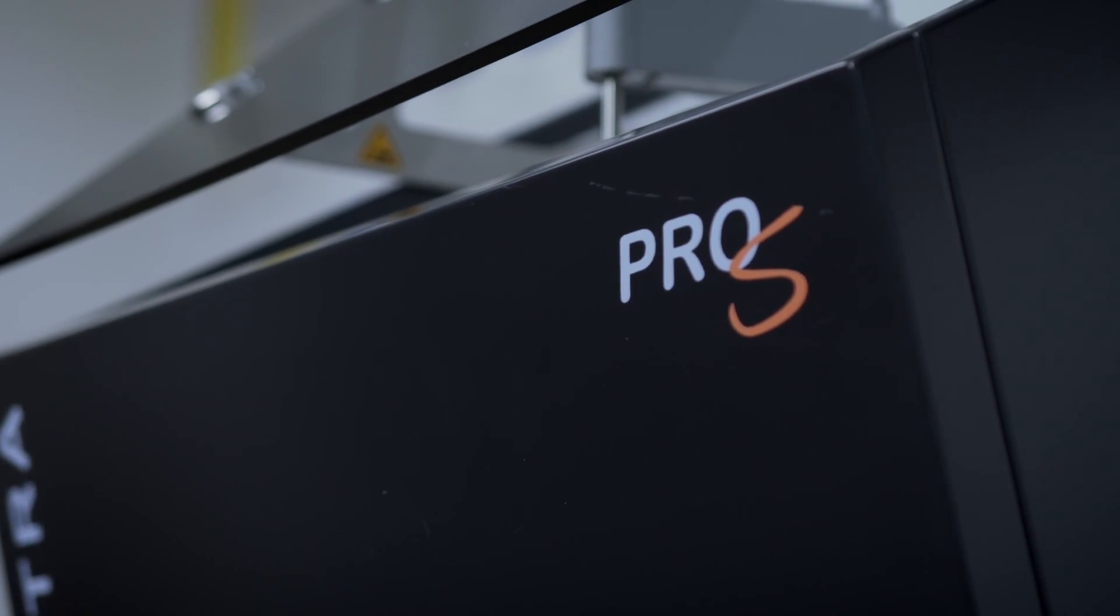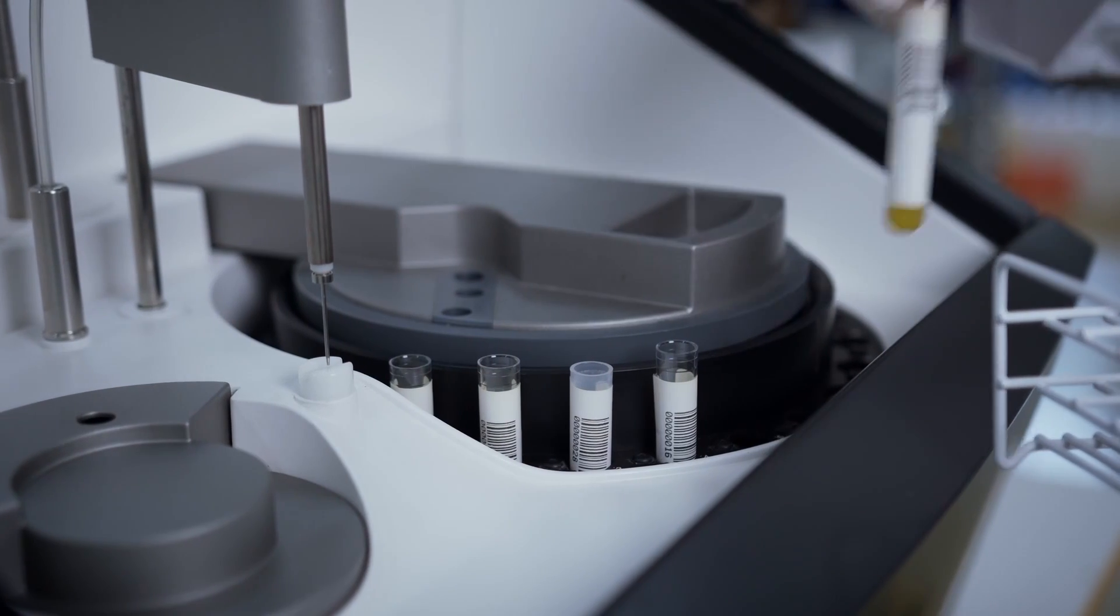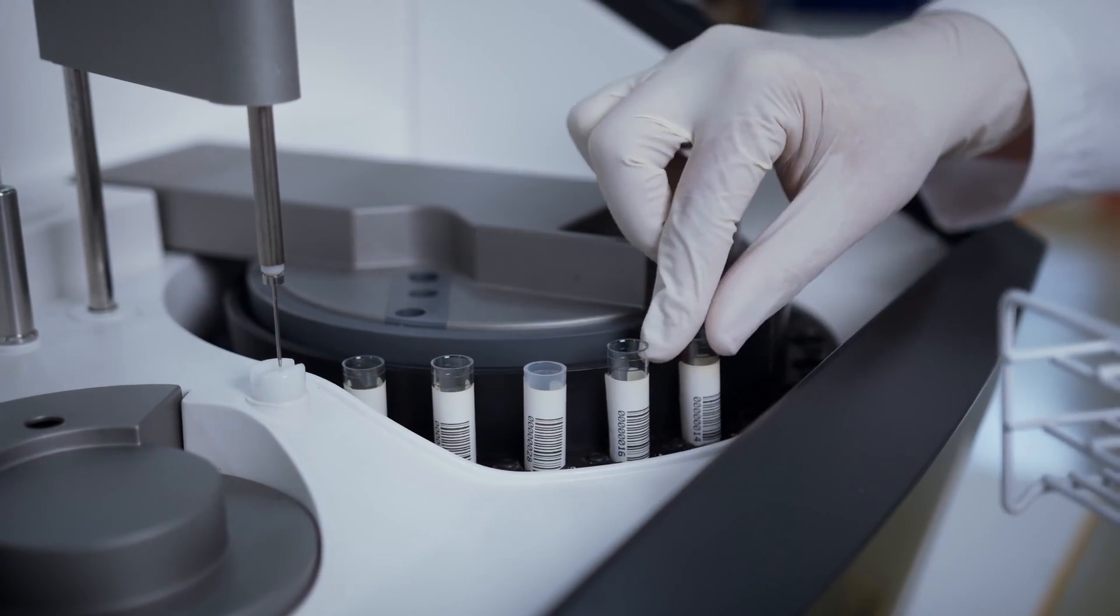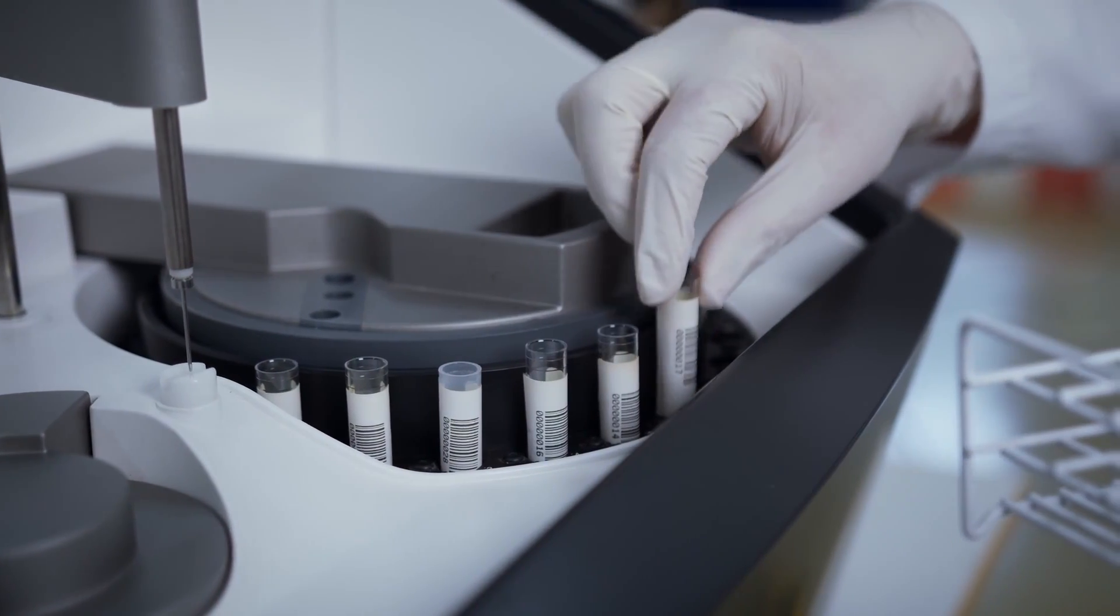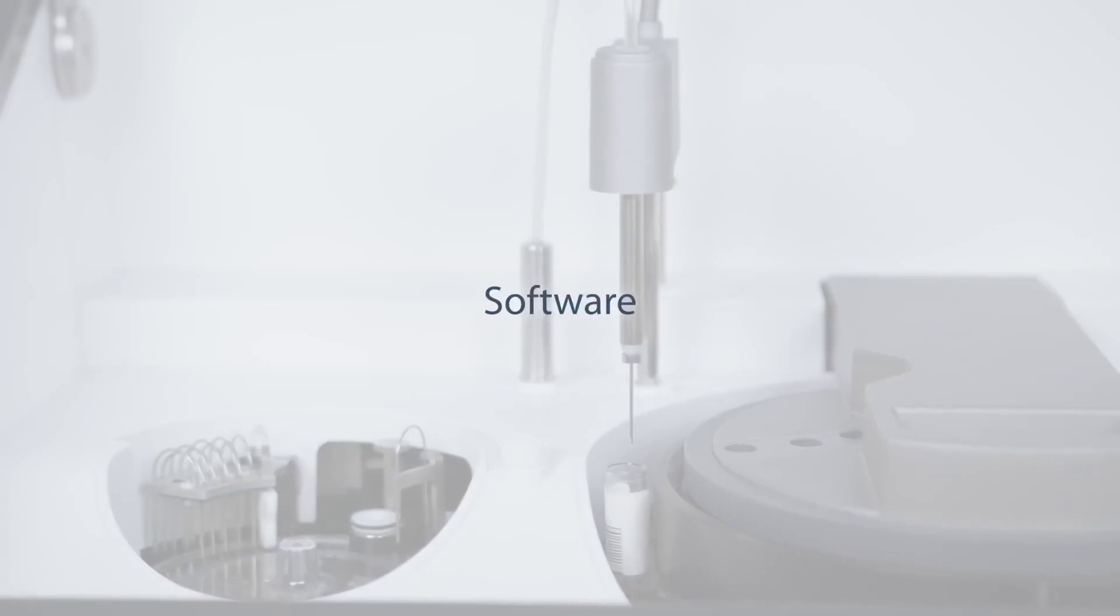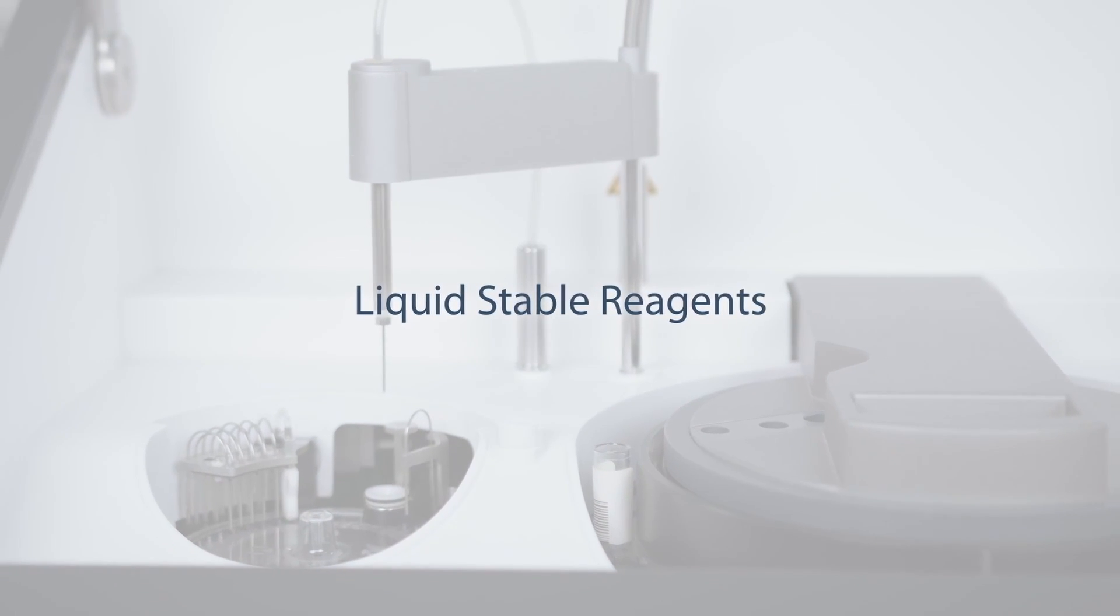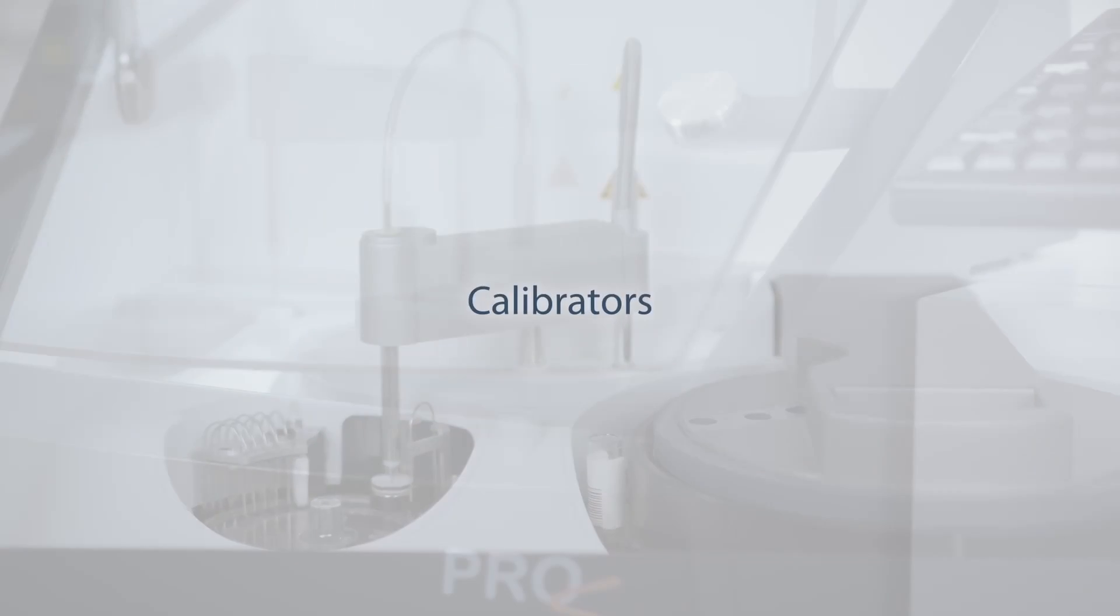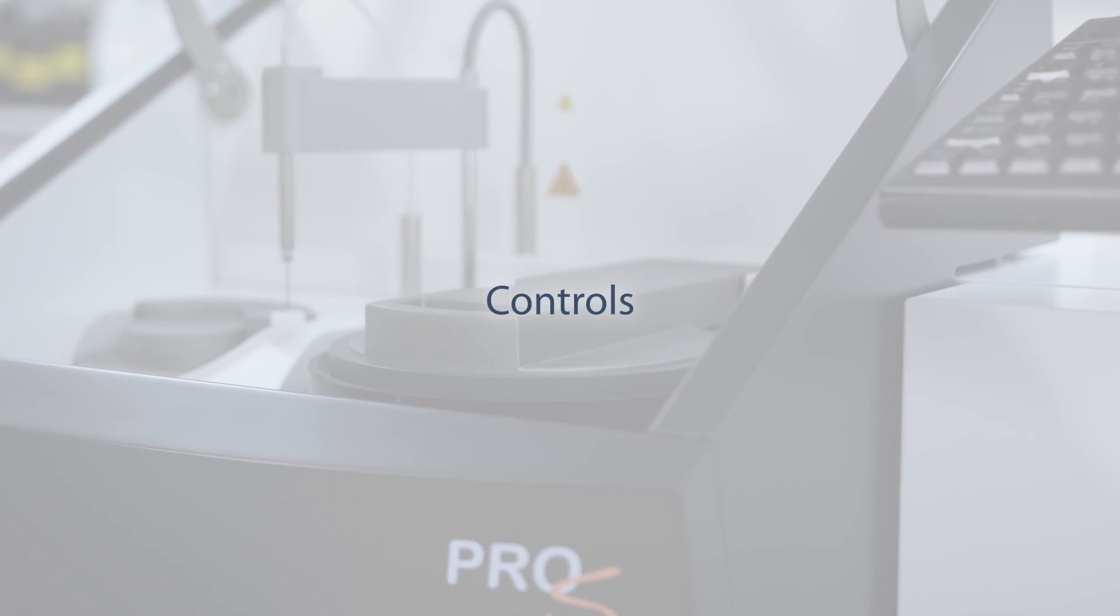The performance and quality of Selectra Pro-S are designed into the complete system across all key components: analyzer, software, liquid stable reagents, calibrators, controls, ISE, and service.